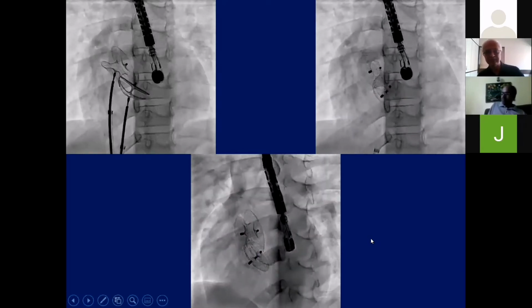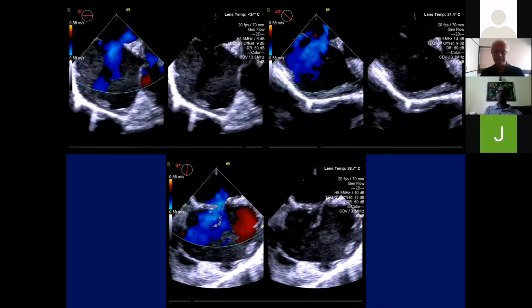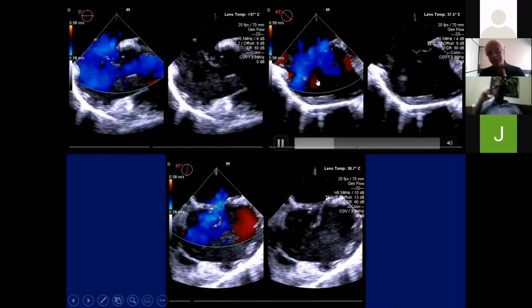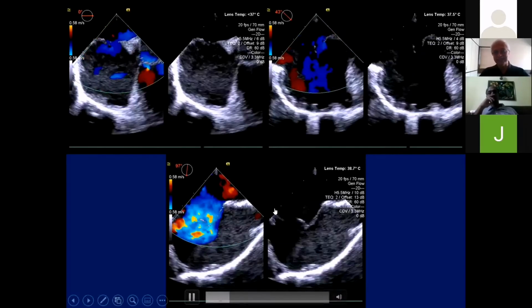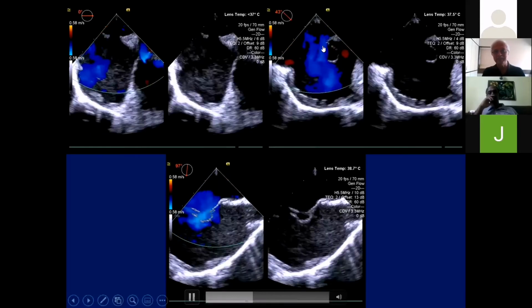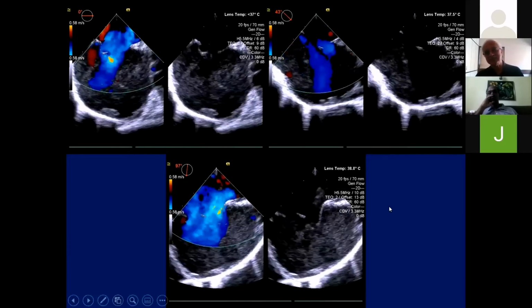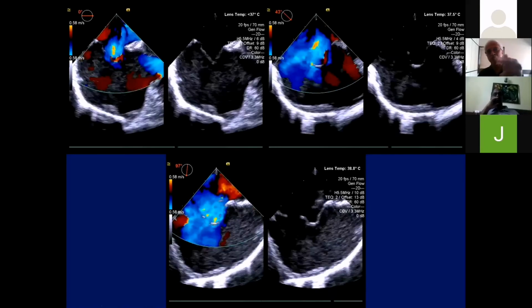Now, this is an example of an aneurysm. You watch this aneurysm very carefully. If you look at this aneurysm, the major defect in the aneurysm is seen inferiorly, you can see here, and is seen posteriorly, as you can see here. Now, what happens is when you try to cross these defects, the chances of you going through the posterior and inferior defect is high.